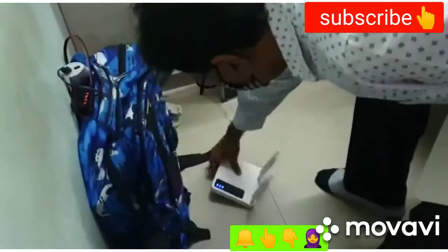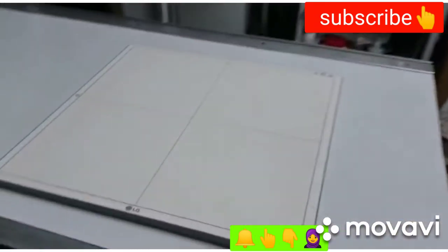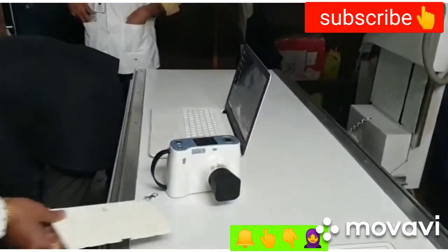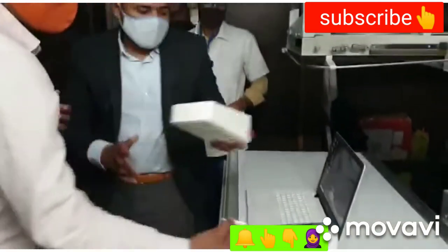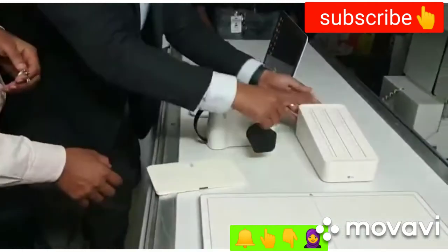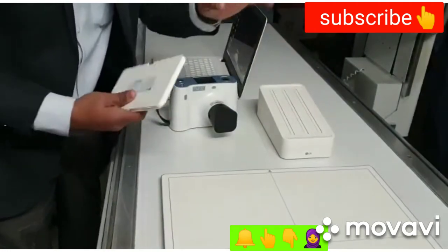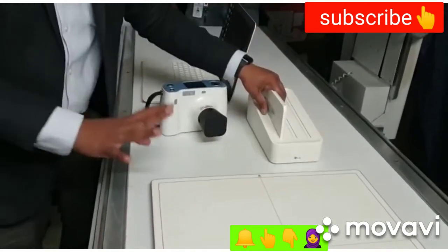You have a router, cassette, X-ray machine, and laptop. Battery works for how many shoots?